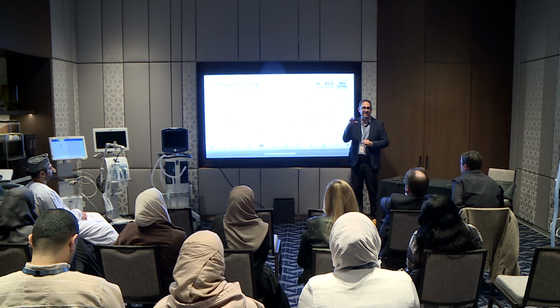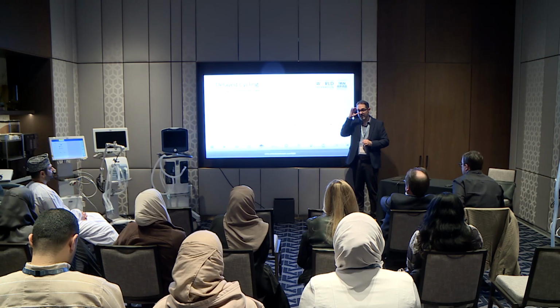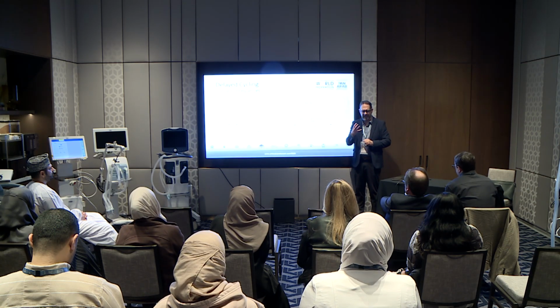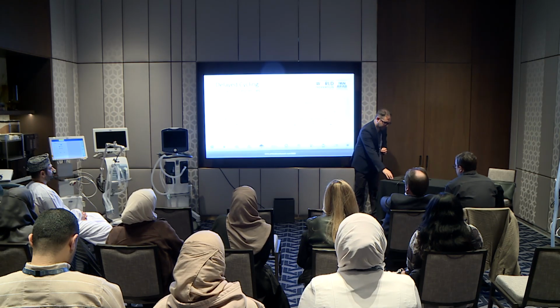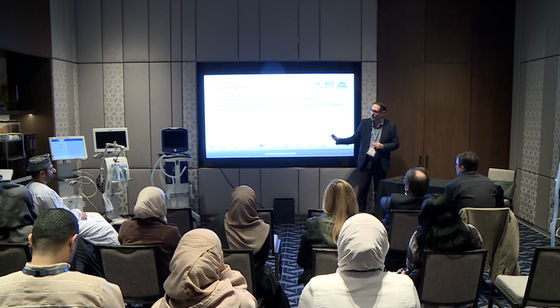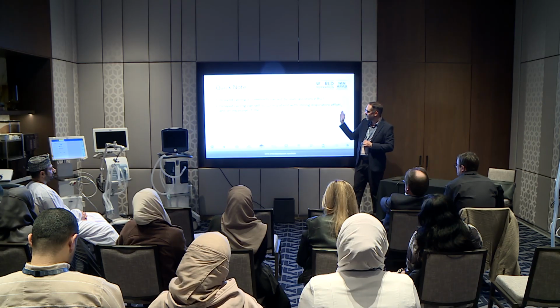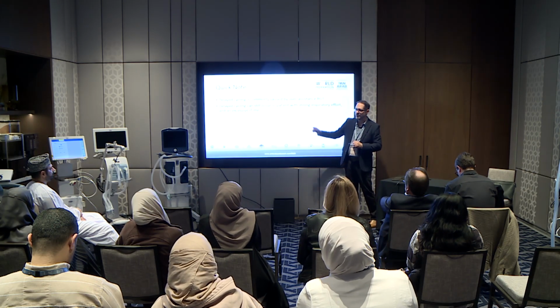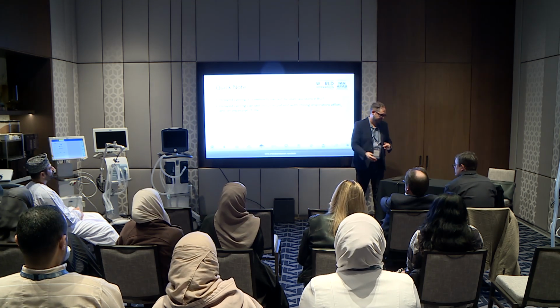If you're setting PEEP at 0 all the time and then titrating up, you're going to see it based on PEEP in some patients. But if you're setting PEEP, and you don't have any evidence of a lot of expiratory flow limitation, it's likely not going to fix your delayed cycling or your ineffective efforts. And just a quick note, I already mentioned this, it's commonly caused by over-assistance in time, but it can also occur in patients with strong inspiratory effort and if you set too long an I time. I showed you the other screens where the I time was too long.